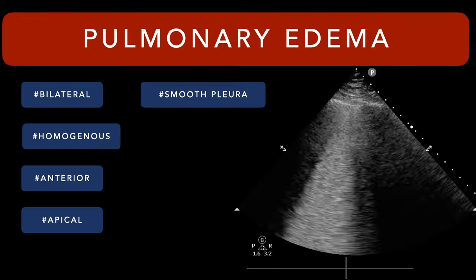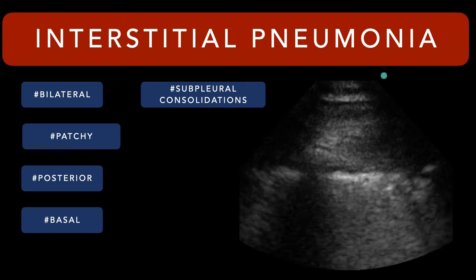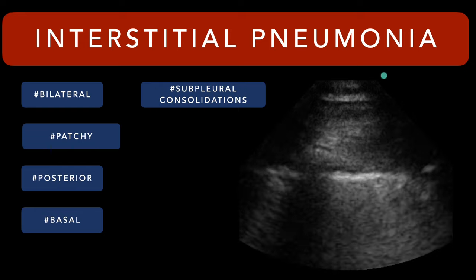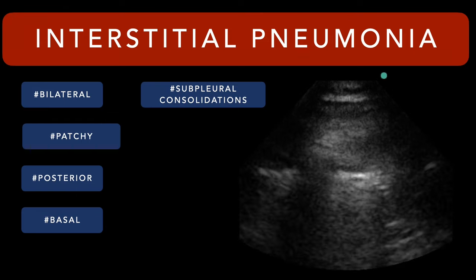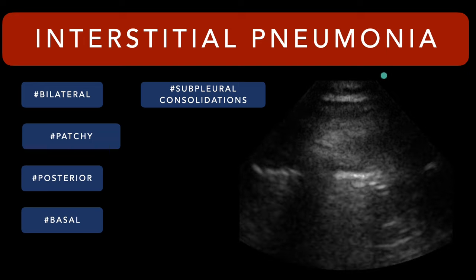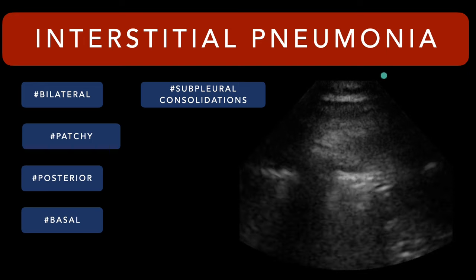Now compare that with 2020, when we got COVID pneumonia and were presenting with patients with B lines. Okay, they have some interstitial thickening, but what's causing that? Their clinical scenario is they're coming in with cough and a fever. It's 2020, they have COVID, or they might have COVID. What we'll see is it's probably still going to have the same bilateral nature of these B lines. If we scan both sides, we're probably going to find areas of B lines on both sides.